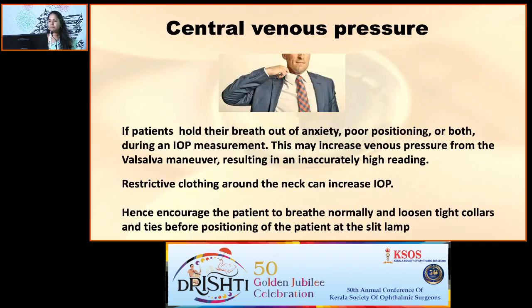And most of the patients, when they sit in front of a slit lamp, hold their breath out of anxiety or poor positioning. That will increase the central venous pressure because of the Valsalva maneuver, and that will cause an overestimation. Similarly, if they're wearing tight neckwear, that can cause an overestimation. So ask the patient to breathe normally, make them calm, and loosen tight collars before positioning them on the slit lamp.